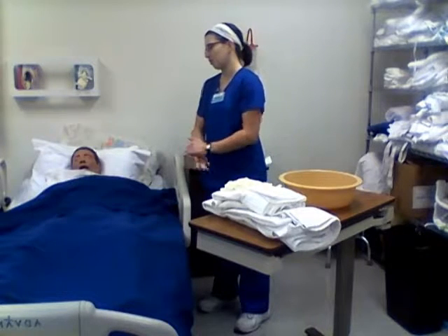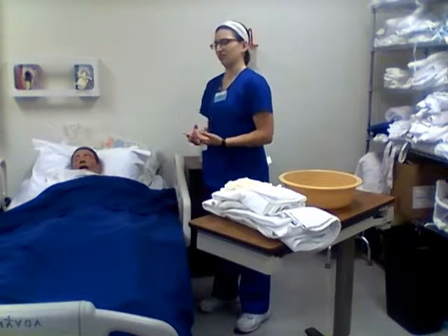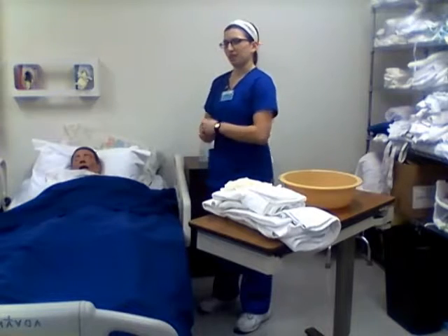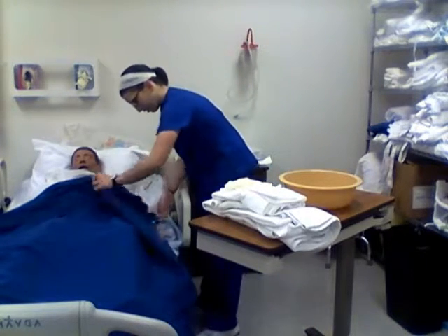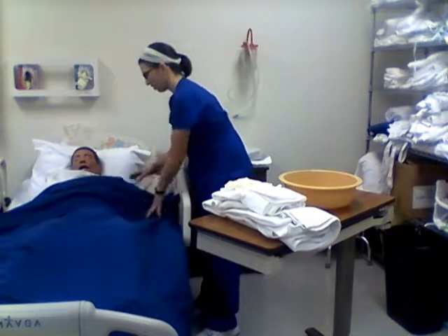So, hello, Matt, what is your name and date of birth, please? And she's going to respond with that information. I'm going to check that against her wristband. So looks like everything checks out.